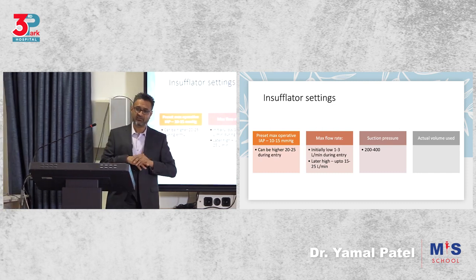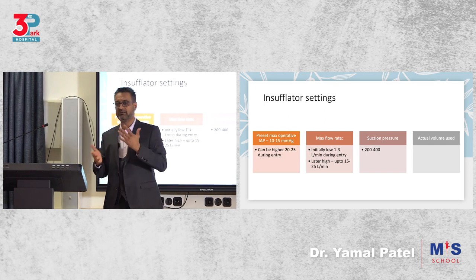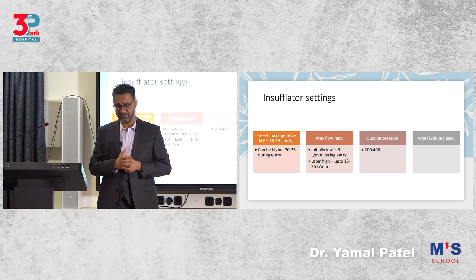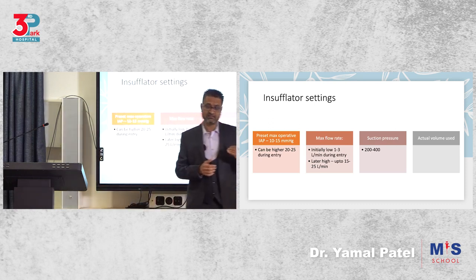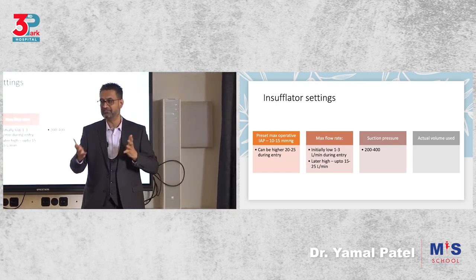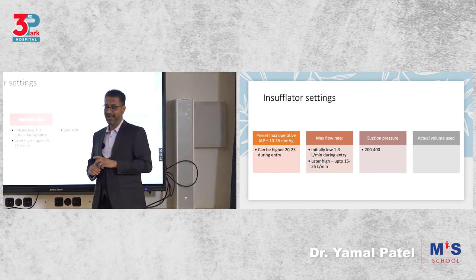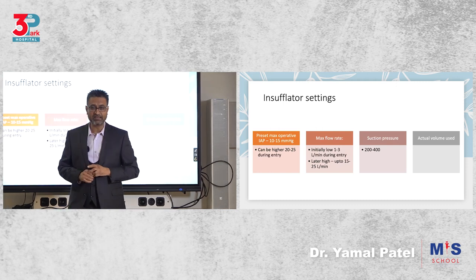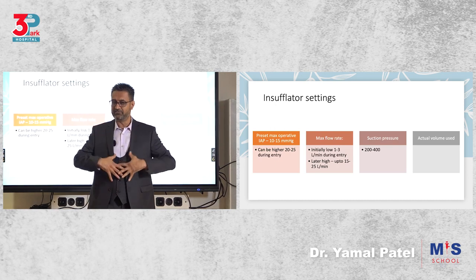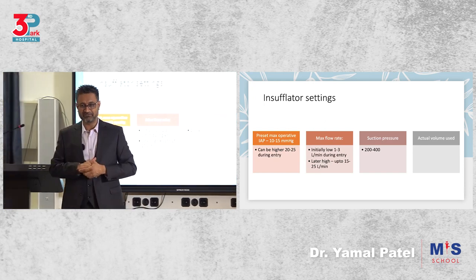If you're doing a pediatric, let's say a pediatric, not very young, around 10, 12, 14-year-old, you're operating at pressures around 10 to 12. If you're operating on younger kids around, let's say 4, 5, 6, your pressures are about 8 millimeters of mercury. And if you're operating on neonates or infants, then your operating pressure is just enough to create the cavity, because the abdomen is not very tight. The muscles are not developed. You get what I'm saying?